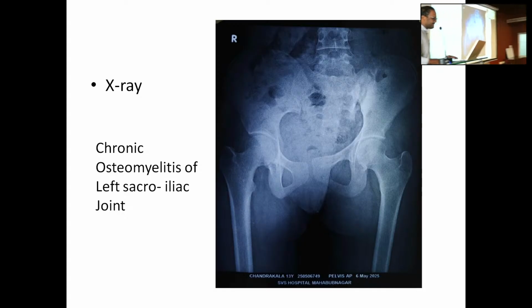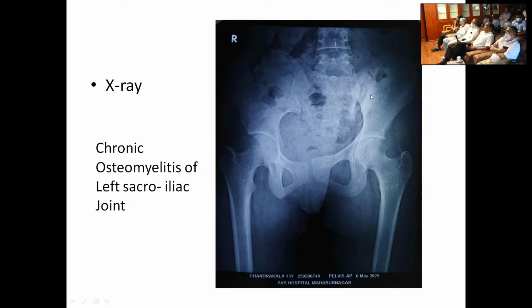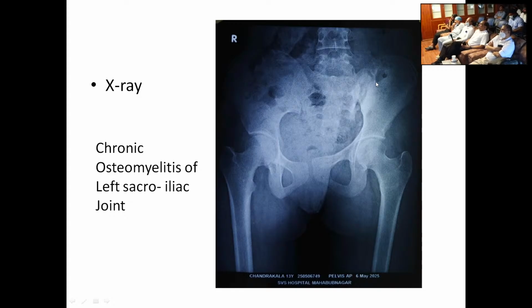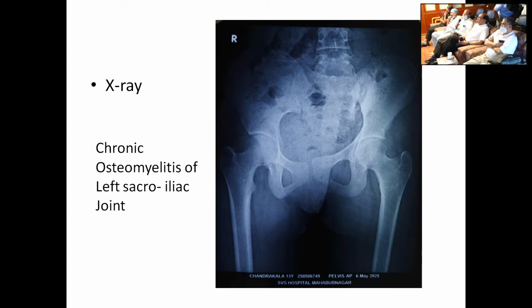Can you see where is the osteomyelitis? Describe the extent. The joint margins are eroded. There is surrounding sclerosis. So in the presence of sclerosis, we thought it might have been a pyogenic bacteria. If it is grossly porotic with erosion, tuberculosis is the first possibility. But a significant amount of sclerosis is there. And of course, AFB may not be positive. You may not get a bacterium there, it is all necrotic material. Secondary, yeah, quite possible.